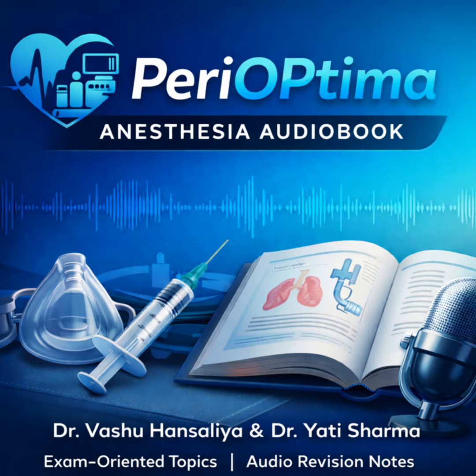Okay, so beyond awake versus asleep, we also have the choice of route. Oral versus nasal. What guides that decision? It depends on anatomy and your clinical goals. Nasal FOI is often, believe it or not, technically easier for the operator. How so? The nasal passage acts like a natural guide. It forces the scope to stay midline, and the tip usually points right at the glottis as it enters the oropharynx. And critically, it's the preferred method when mouth opening is severely limited. Trismus, mandibular fractures, that kind of thing. Exactly. Cases where you couldn't even get the scope in orally.